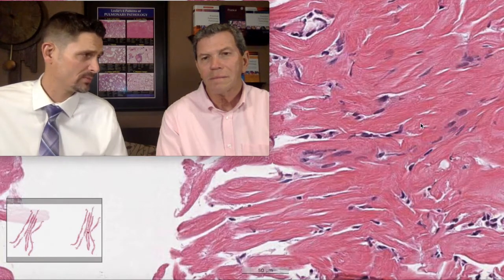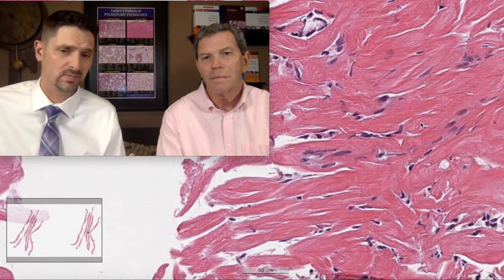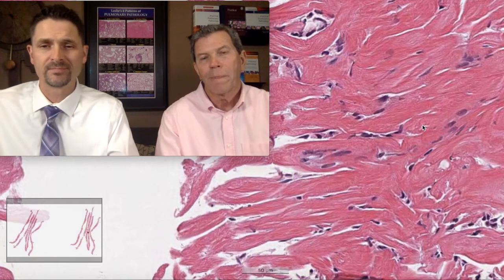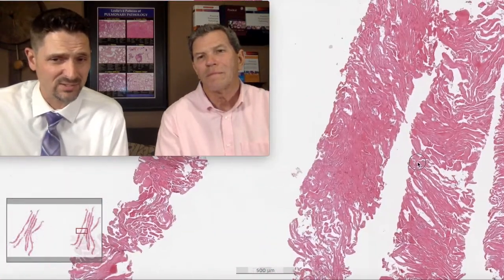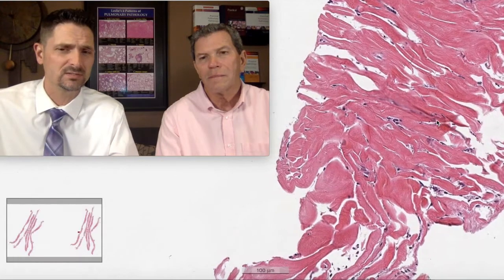And I'll tell you, most pulmonary hyalinizing granulomas have almost zero cells. Right. It's just keloid-like scar, remarkable in their acellularity. Exactly. And so this one has some cellularity. It's kind of patchy throughout the biopsy. There are some areas with cells and other areas with no cells.